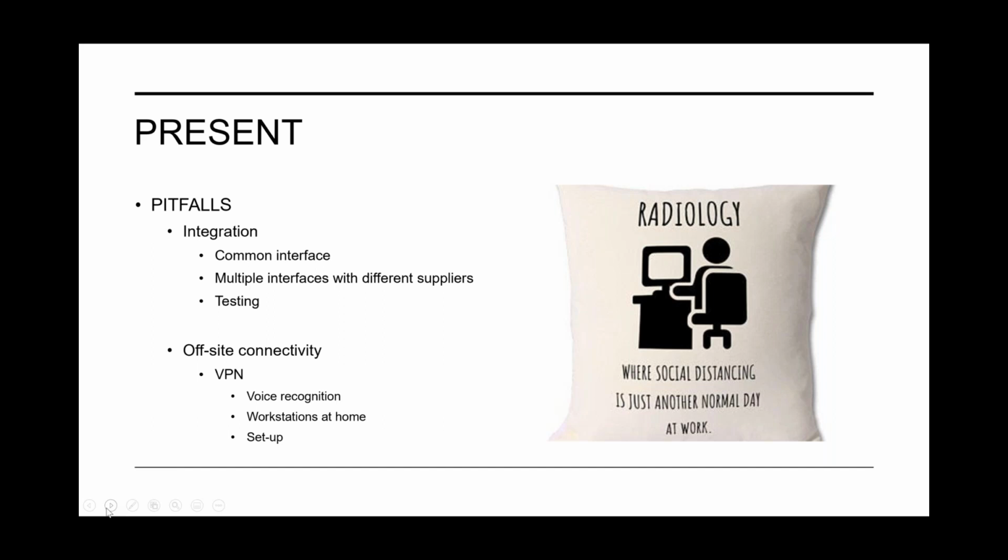And certainly with COVID, when it came to offsite connectivity, we had to look at more imaginative and innovative ways of using radiologists at home who were shielding. And that in itself has had issues, certainly with voice recognition. How do you get workstations configured and set out to users at home? Because if they're using our own VPN solution, they needed to have these systems pre-configured with the person's profile, and then who did the setup. And I do remember sometimes having to talk colleagues through how to set up and connect monitors.